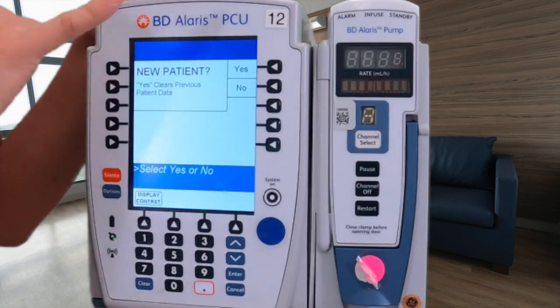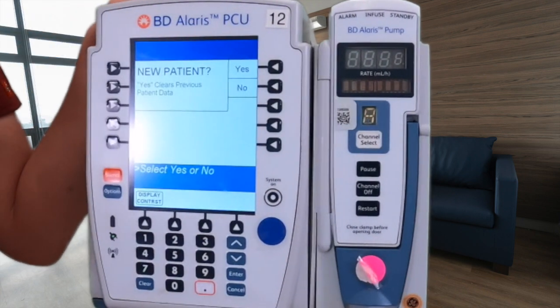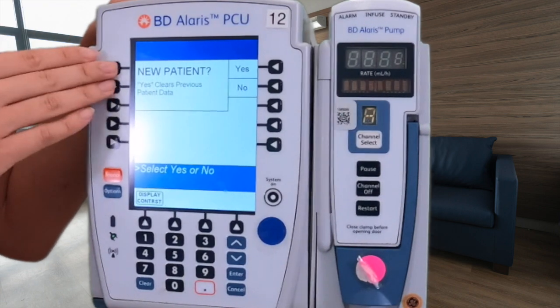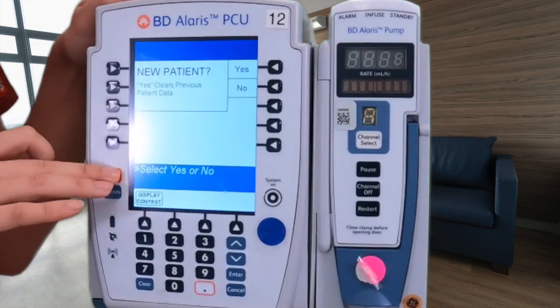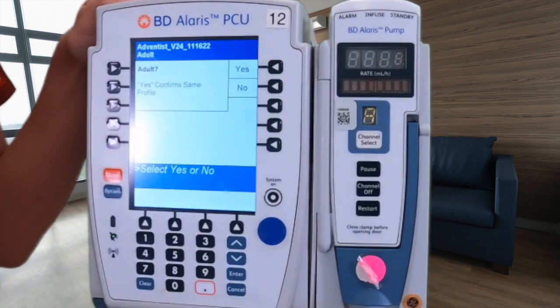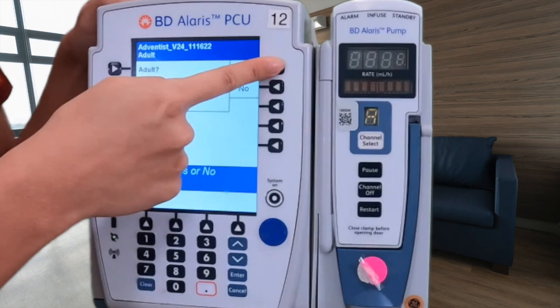Because this is a new patient, we're going to select yes. If this was a patient you've had in the past or you want to continue your regular fluids, you would usually say no. But because this is a new patient, we're going to press yes. And it is an adult, so we're going to press yes.